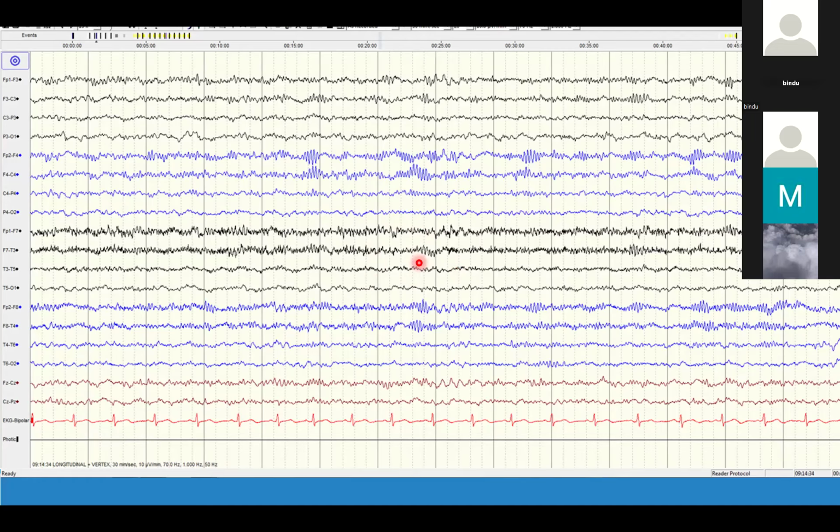Yes, and beta activity over the frontal areas. Okay, sir.